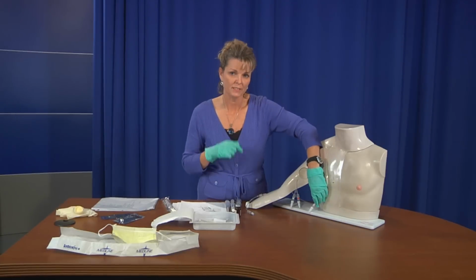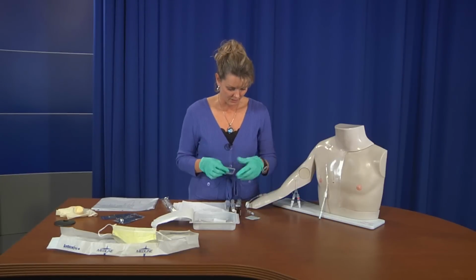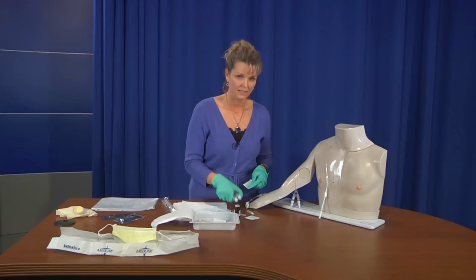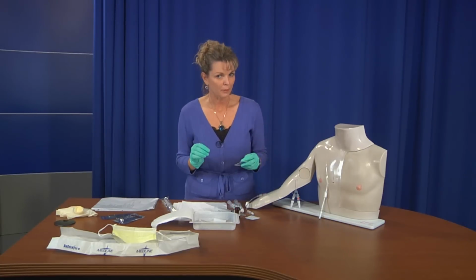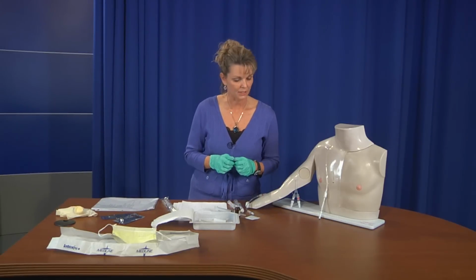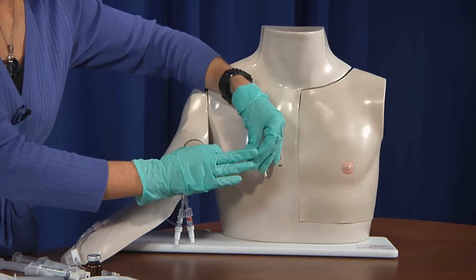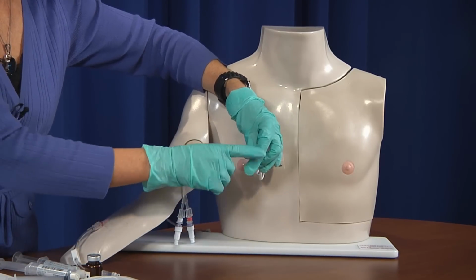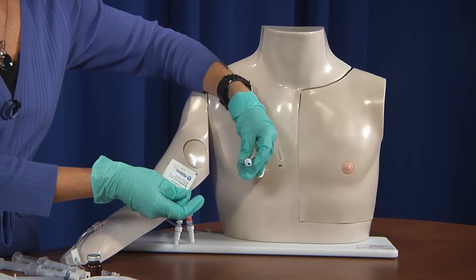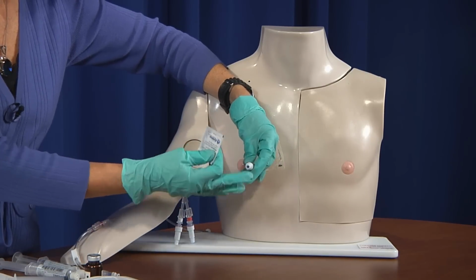But for now, what you need to know is how to flush and how to give medication. You're going to need some alcohol. You're going to need your medication, your syringe with your needle, and 2 flushes. For your purpose, everything will be done with a 10 cc syringe. The main thing that you need to know is that every hospital has different types of ports or locks. These needleless caps, there's different types in every hospital. And therefore, you have to do it in the way that the product or the company says that you need to access it. So each place is different.